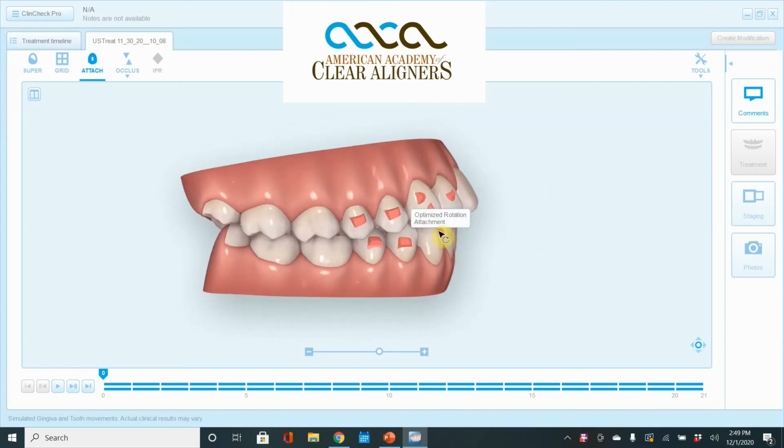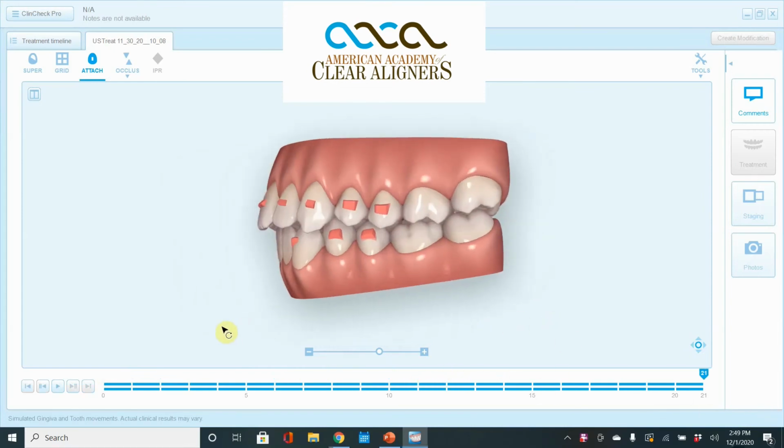That will get rid of half the open bite. Then we should be able to put G4 attachments on the anterior teeth and pull for home. And it's kind of what the program does, trying to straighten them first and then pulling for home. The problem is that we still are left with a little bit of flare.